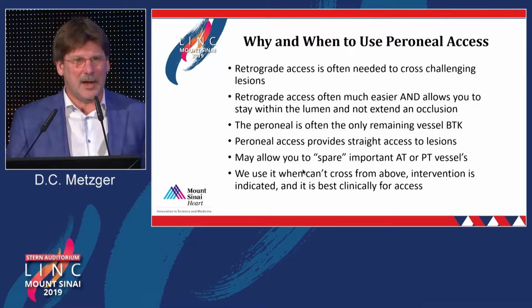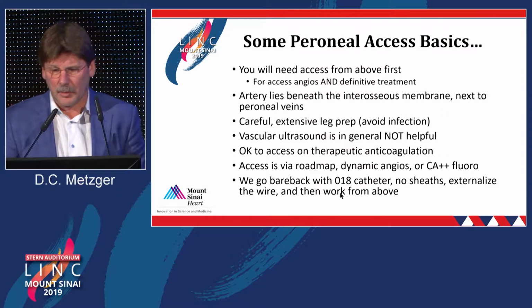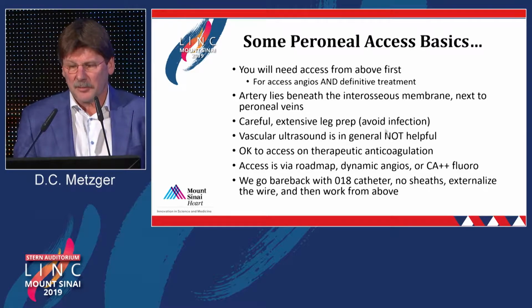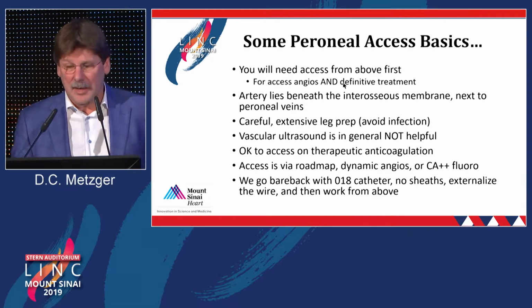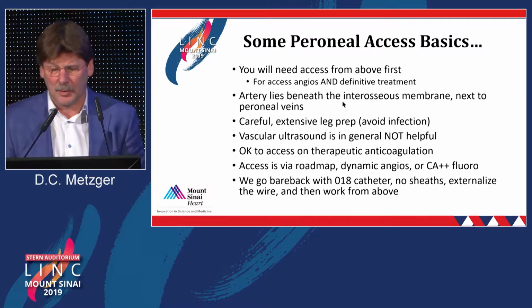So we use it if we can't cross it from above, and the intervention is indicated, and we think it's best for success, and that's not infrequent. So, some basics for peroneal access: in my opinion, you need access from above first, both for angiograms to help in the peroneal access and for ultimate definitive treatment.